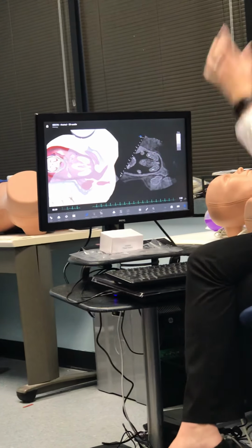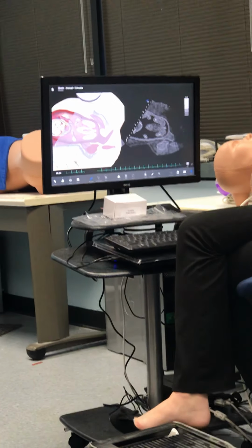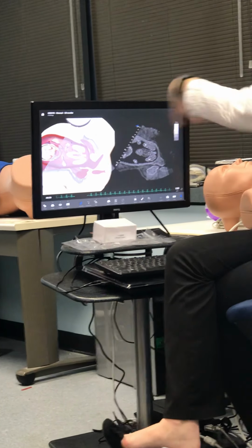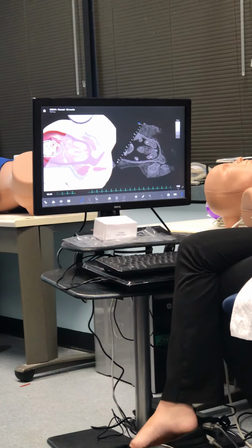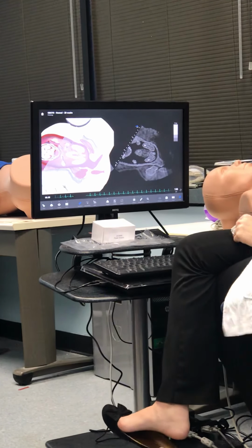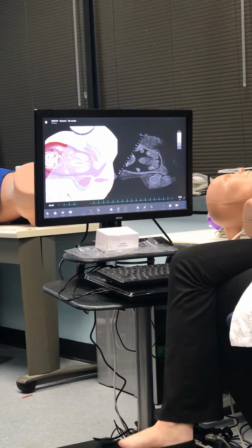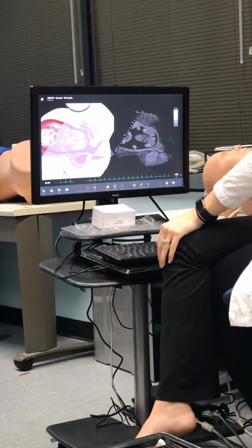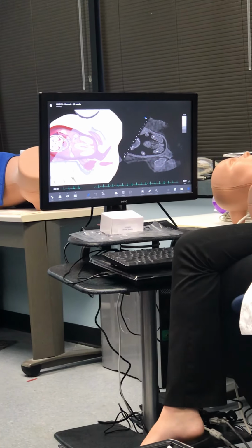For presentation, remember that you are demonstrating where baby is laying in relation to maternal long axis. Okay, so your presentation image should always be in sagittal, maternal long axis, right? Because that's you going along with mommy. You want to get the cervix, because the other portion of presentation is not only where is baby laying in relation to maternal long axis, but what portion of baby is closest to my exit? Cervix. Cervix is how baby gets from in to out, right?